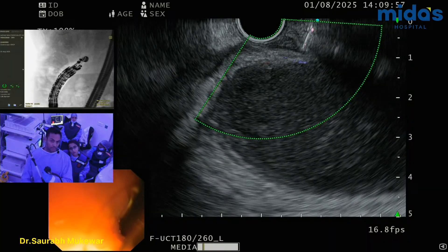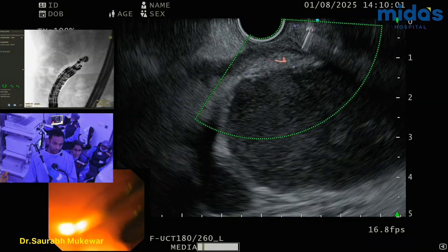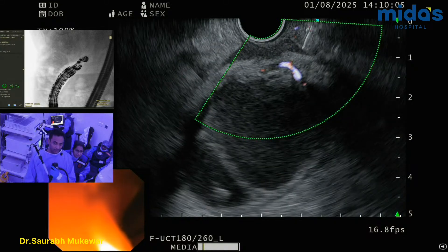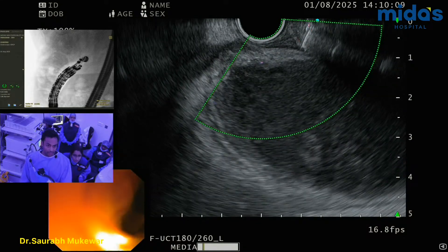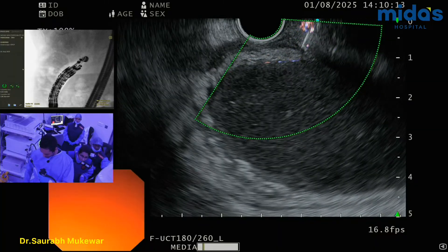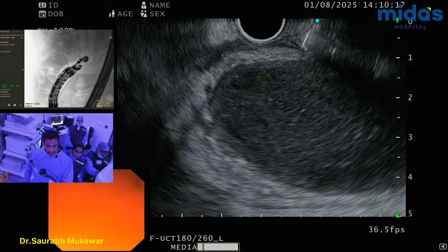There you go. So I'm going to push the scope in, making it more stable. Tent it up a little bit. No — too much vessel. Here, again over here. So this is my only bet. A little unstable — well, not unstable, but more torque on the scope. But I think we are fine there.